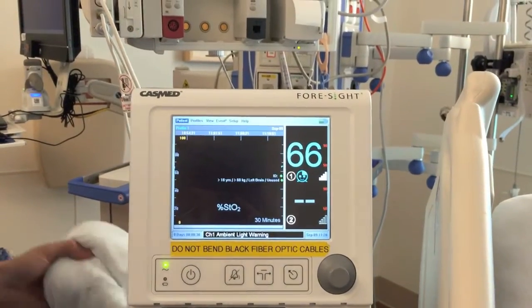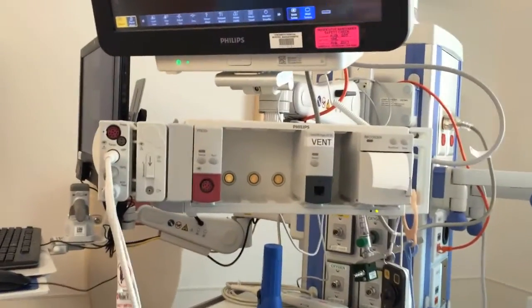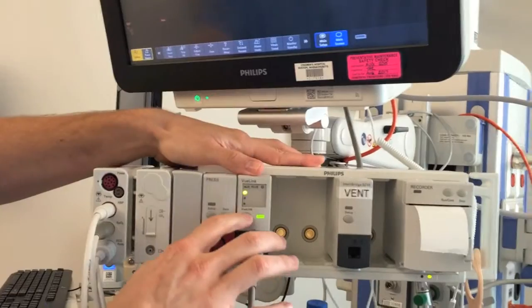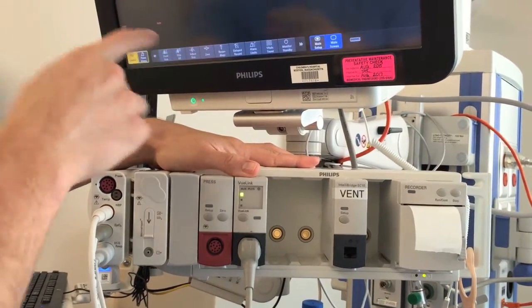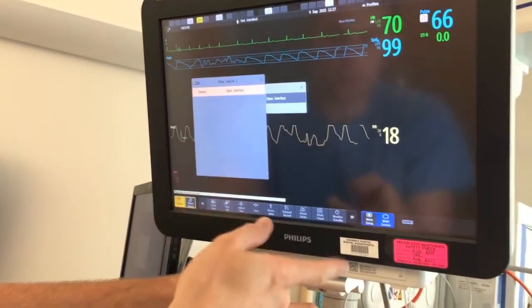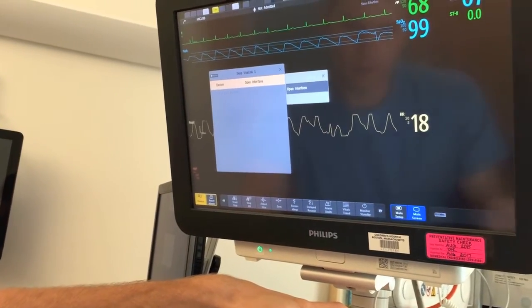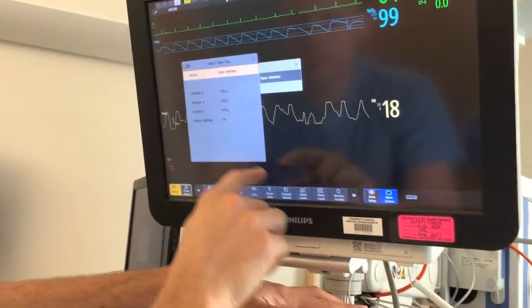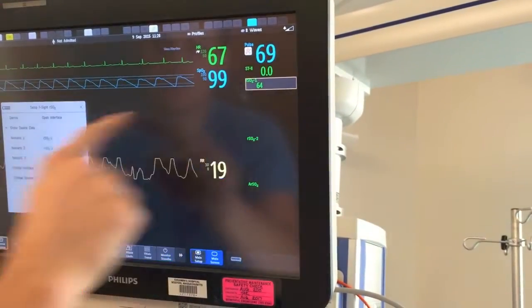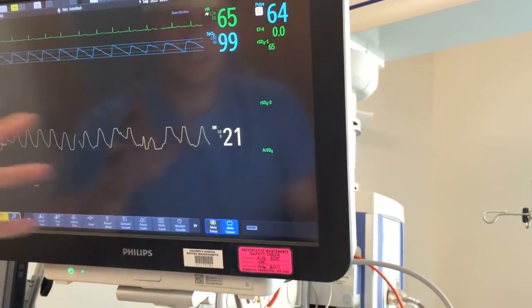The monitor comes with a brick that can connect to our Philips monitor. To connect it, just plug it in like any other brick and hit the view link option. This allows you to bring the NIRS reading up on the Philips monitor, but it won't transfer into PowerChart — you'll still have to go into your flow sheet, select NIRS as an option, and manually transfer the information from the monitor into PowerChart.